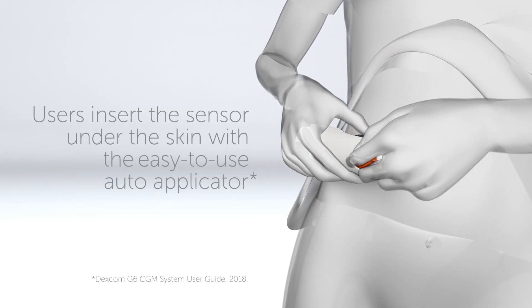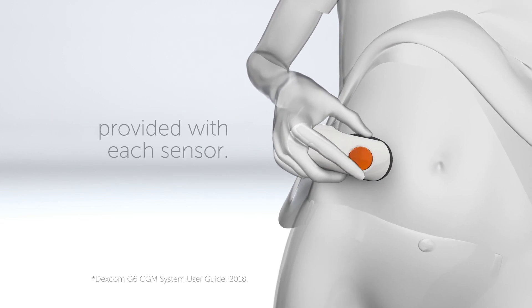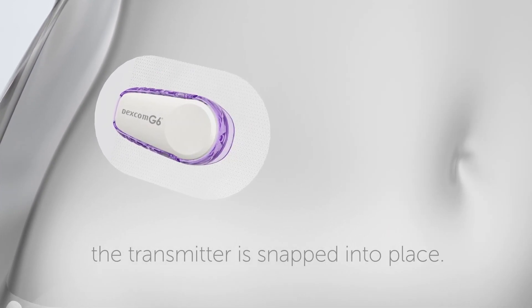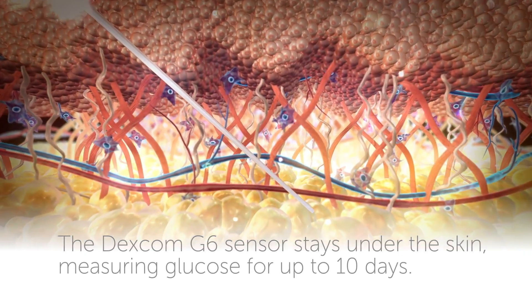Users insert the sensor under the skin with the easy-to-use auto applicator provided with each sensor. Once the sensor is inserted, the transmitter is snapped into place. The Dexcom G6 sensor stays under the skin, measuring glucose for up to 10 days.